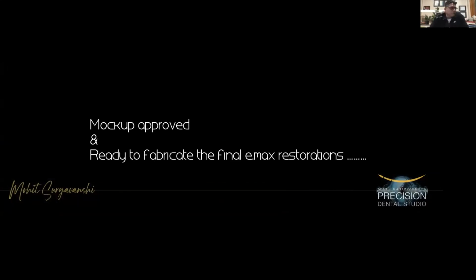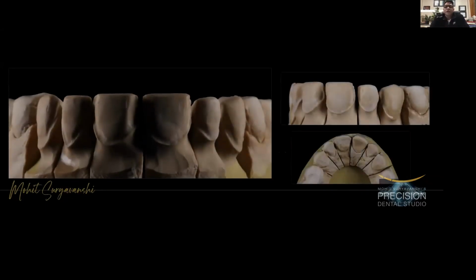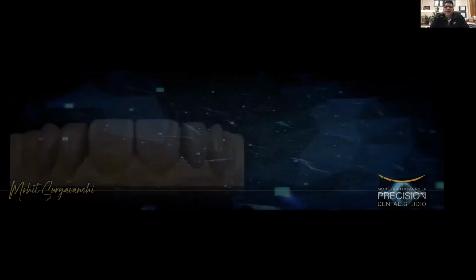We send it to the dentist. He makes a silicon matrix. He transfers it into the patient's mouth. The mock-up is approved, and we are heading for the final restorations, which are going to be made, the anteriors primarily in lithium disilicate, and later on.